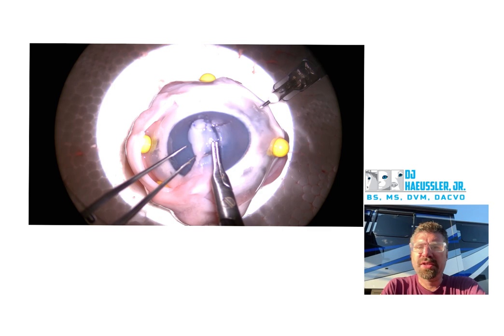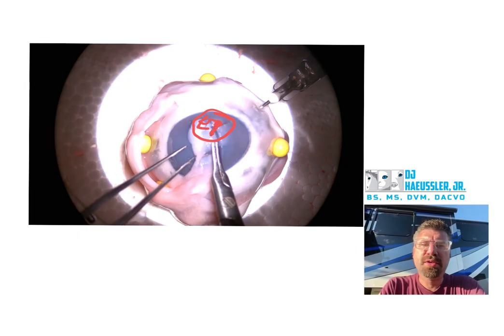There's a sort of issue going on right here — your suture is too far that way. It should be right at this corner.